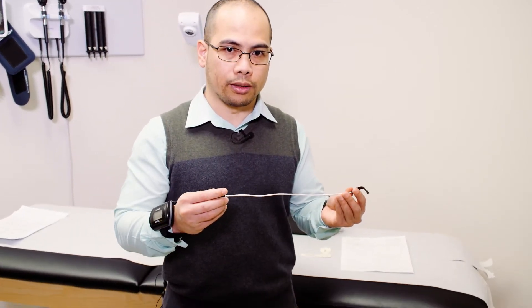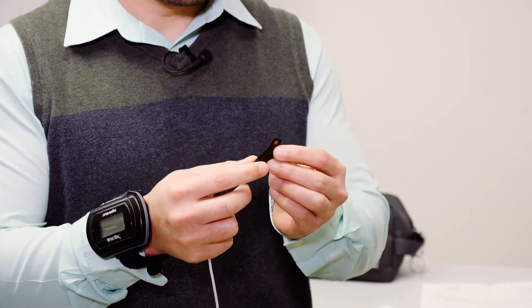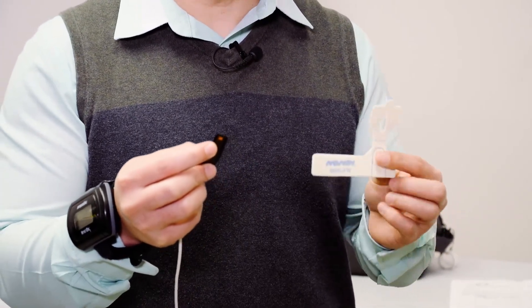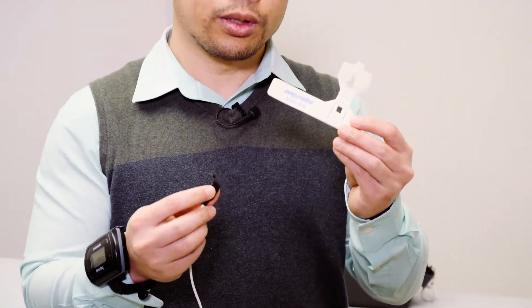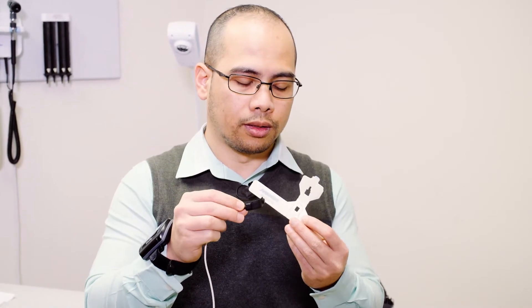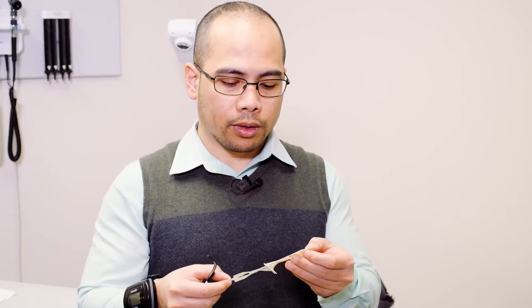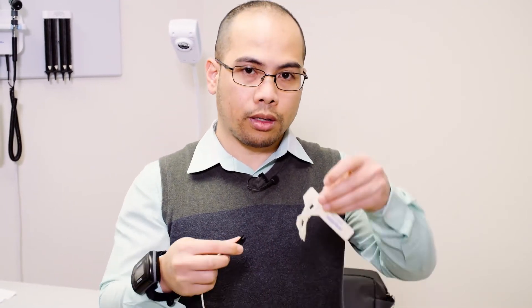The other part of the sleep recorder would be this sensor here. This part needs to be attached to your finger. For this to be able to wrap around your finger, it needs to be held in place by this adhesive. There are two holes here that correspond to the prominence on the finger sensor. The first step is to peel off the paper covering from the adhesive.